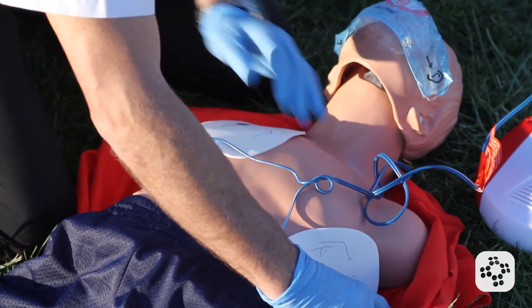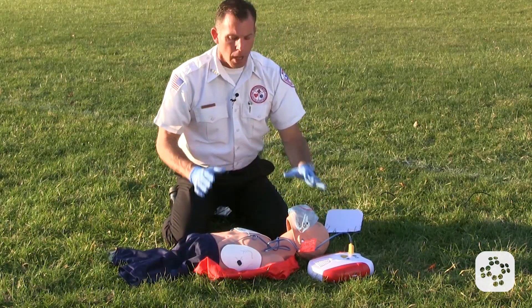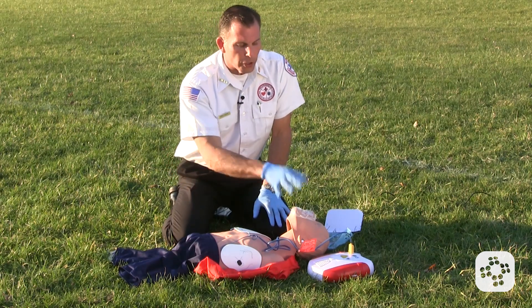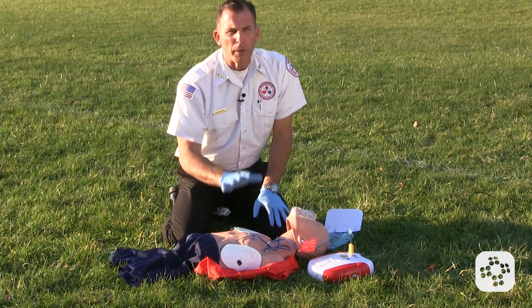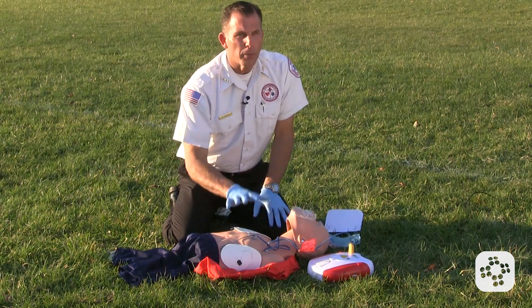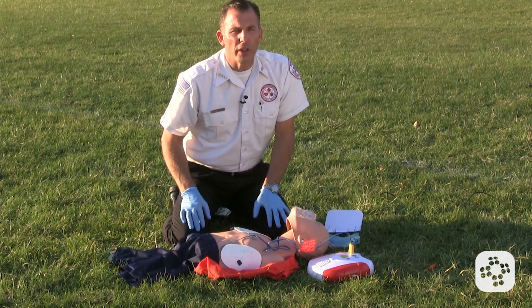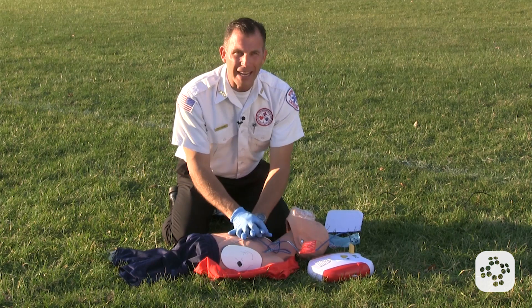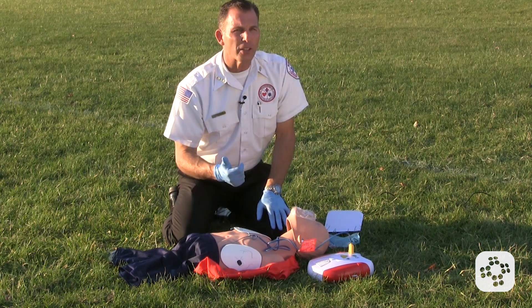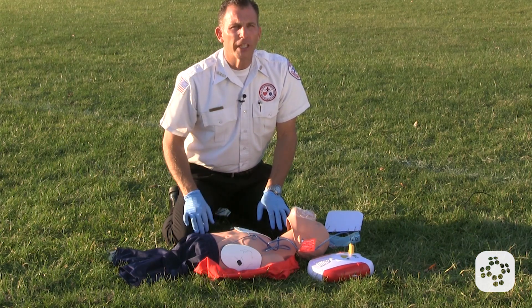If a pad begins to loosen up, you can re-tighten it back down so that it's affixed to the chest. But at no point are we going to remove the AED pads or turn it off — we're going to allow it to stay on while we do CPR. We're not going to interrupt compressions any longer than we have to, even after the shock is delivered. We want to go right back into compressions and minimize those interruptions until EMS arrives and takes over, or the patient begins to respond and starts breathing normally again.